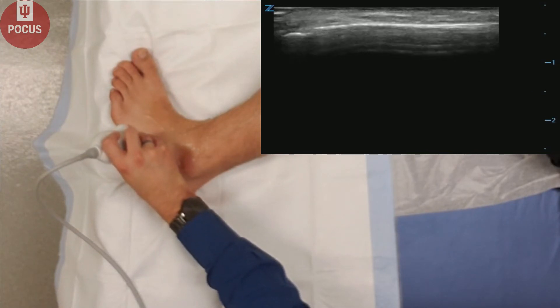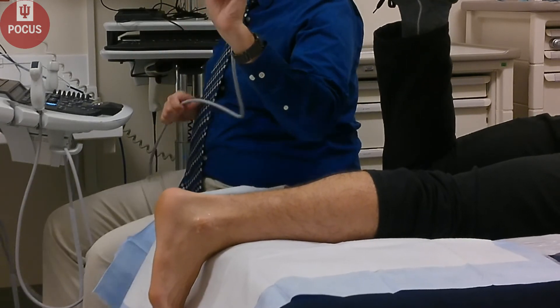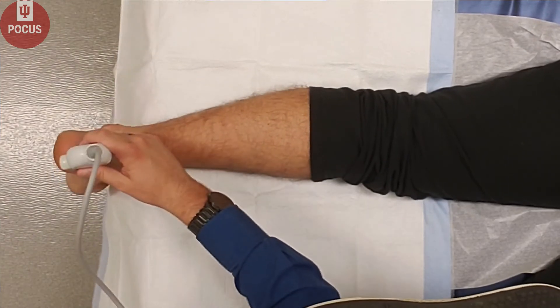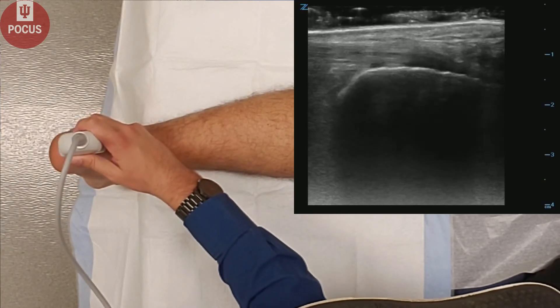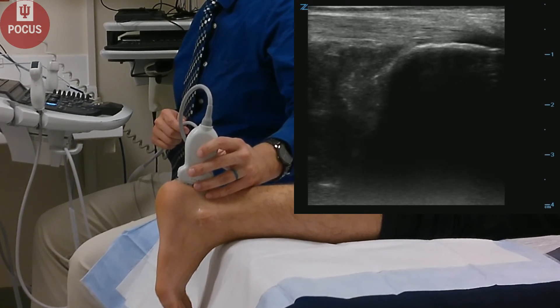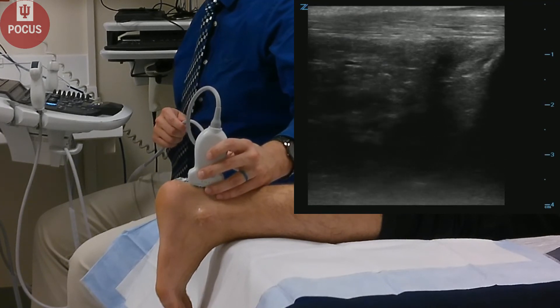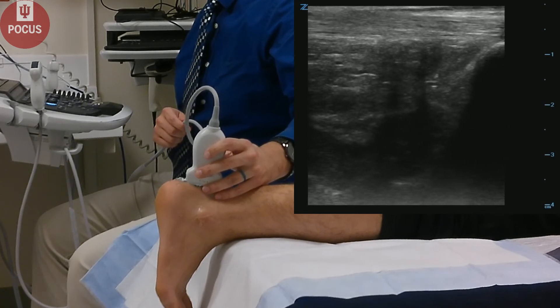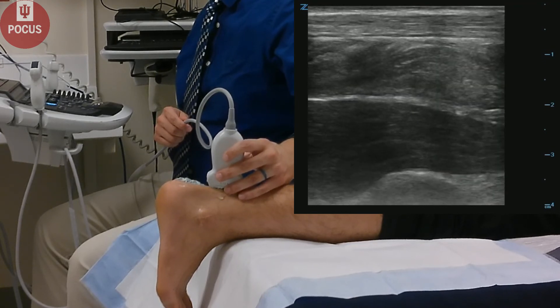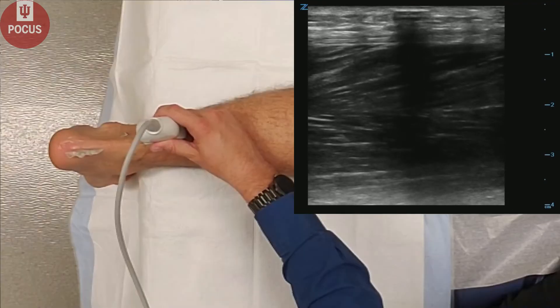And you can evaluate the rest of the metatarsal as well. Next, we'll have our patient lay flat on their stomach. We will look at the posterior ankle. In this orientation, we'll see the Achilles tendon right on the calcaneus, and we'll follow that tendon proximally looking for any signs of tendinopathy, cortical irregularities, thickening of the tendon, or disruption of the tendon. We'll follow that pretty far proximally into the myotendinous junction.